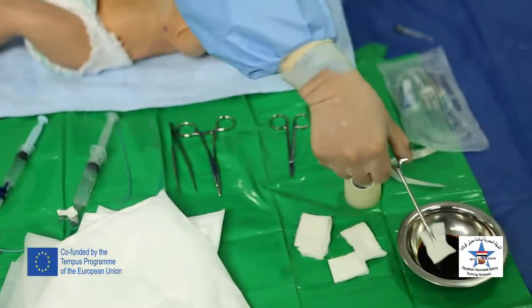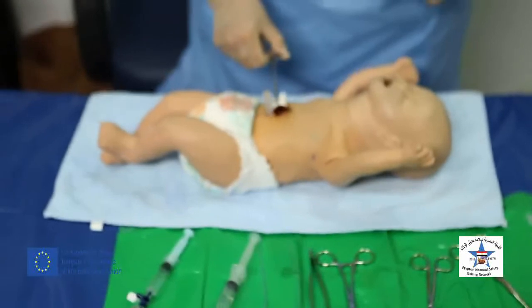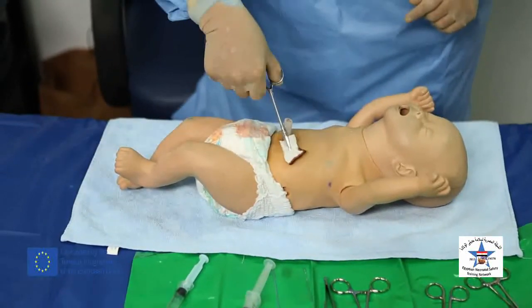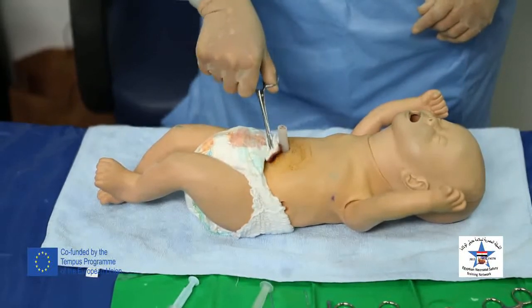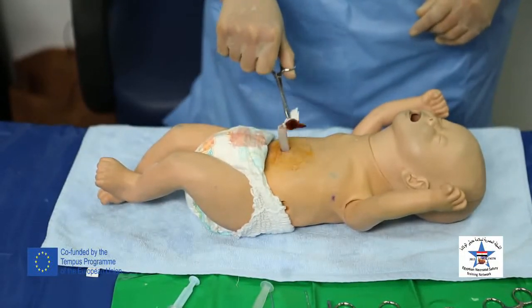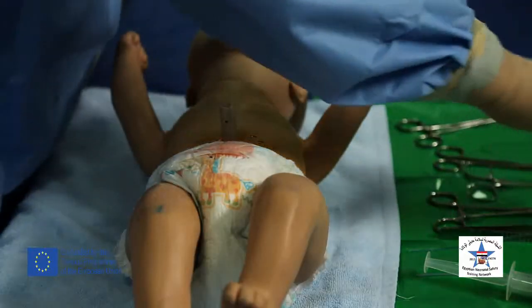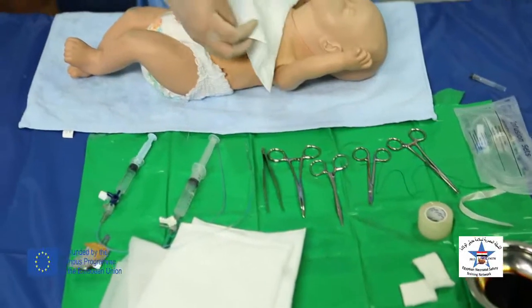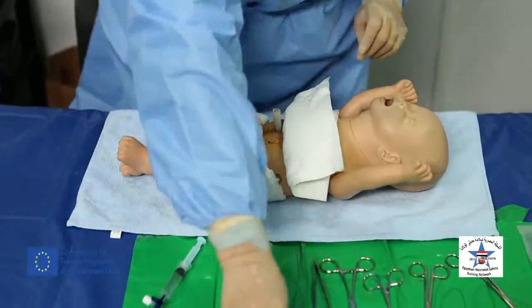We'll sterilize the abdominal skin around the umbilical stump and the umbilical stump. We'll apply sterile drapes around the area.